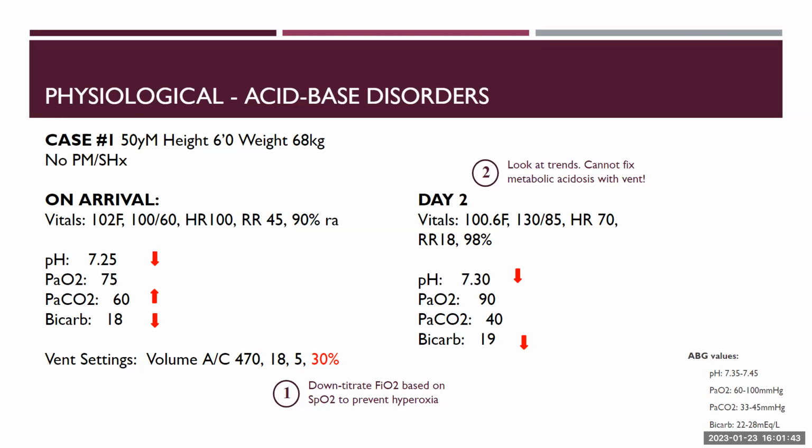So at what point would you consider taking someone off of the vent? Wouldn't there be concern, like if you took them off now, that they would just get respiratory fatigue again? Yep, it depends on the totality of the picture of the patient.